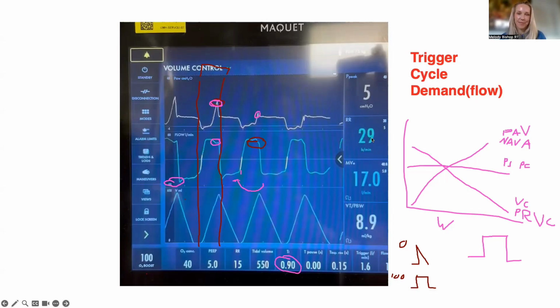Because you can't make the respiratory rate alarms 8 and 12, because then it'd be alarming all the time. But is there a better number than 5 and 30? I don't know. I guess another question I always had, and I'm so glad you're here: in RT school, do they tell you to make the alarms X or Y for some reason, or is that just up to you?